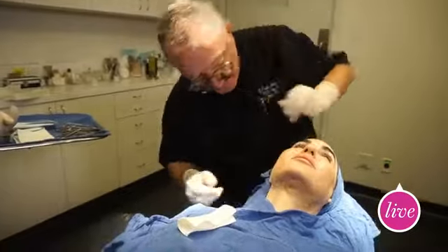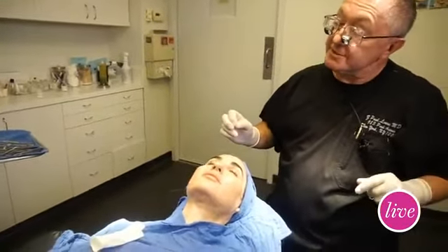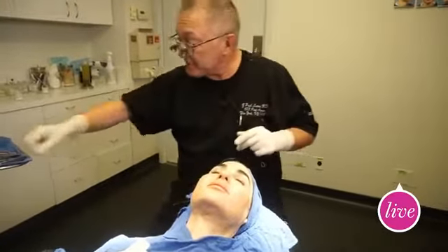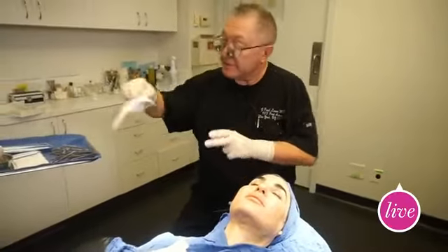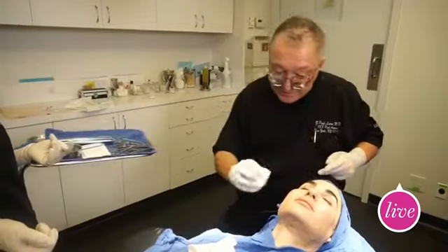Got it. And does the patient have to wait until the sutures are completely dissolved before having it redone? Not necessarily, no. Interesting. No, but typically I see patients, I'm already seeing that first round of repeat patients, because I've been doing this for 2 years. The average is 1.5 years.